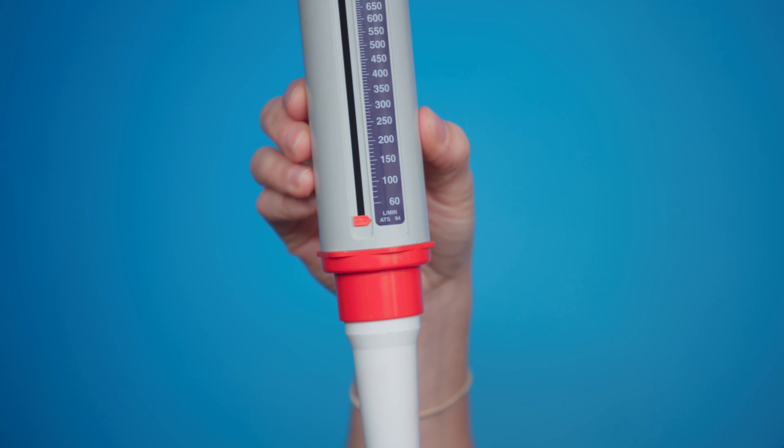When using the Peak Flow, make sure you're standing up straight or sitting up straight for the best result. Make sure that this dial is at zero. You place the Peak Flow this way.